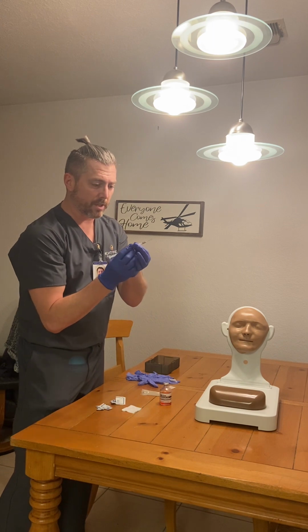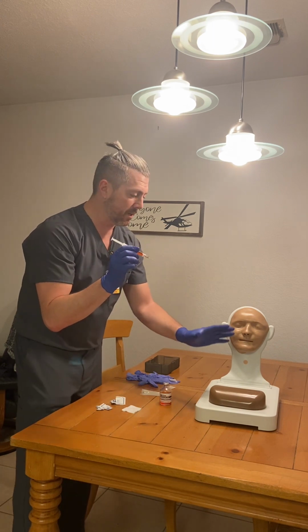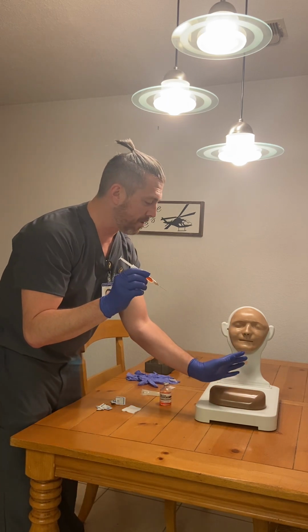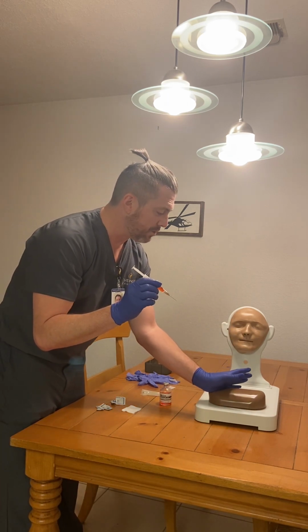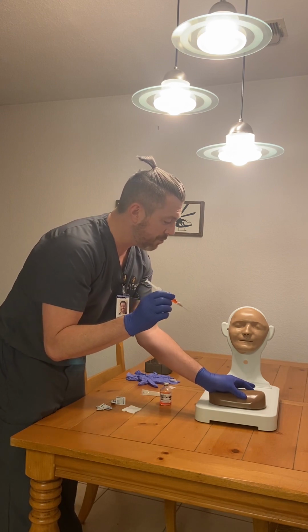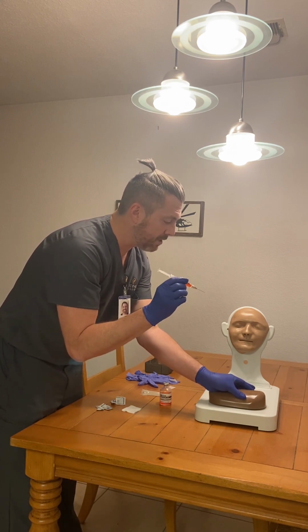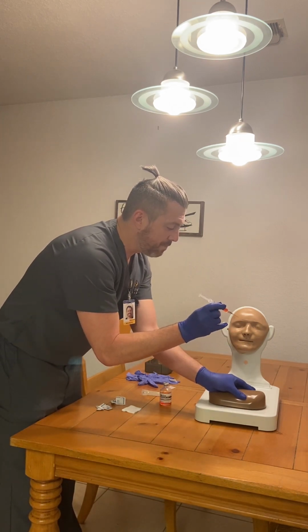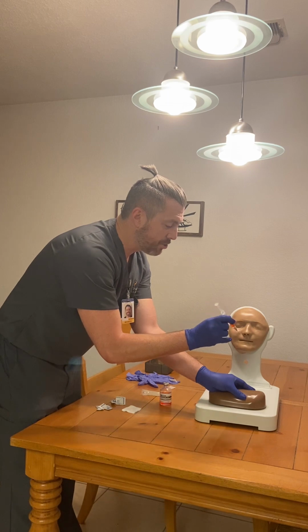I'm going to hold it like a dart, with my ulnar side holding down here and pulling taut, and I'm going to use my index finger and thumb to pull taut the muscle. We still have a clean area between here, and I'm going to pull the skin taut to show the muscle better.